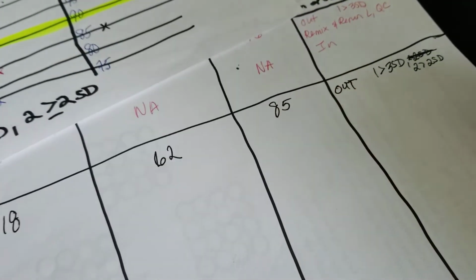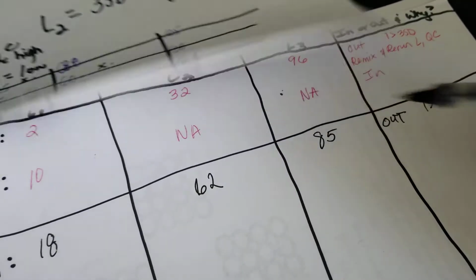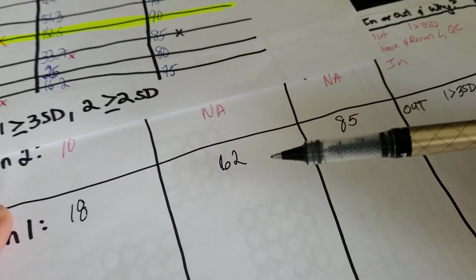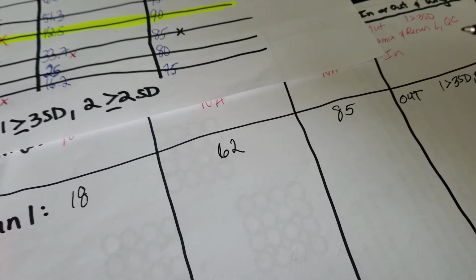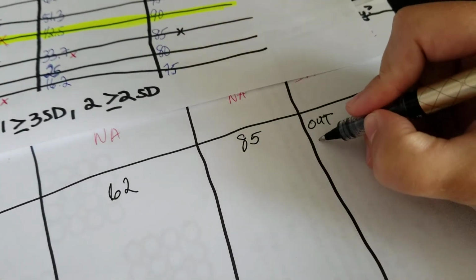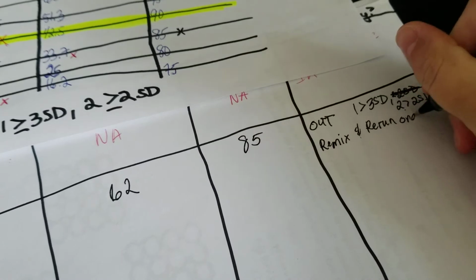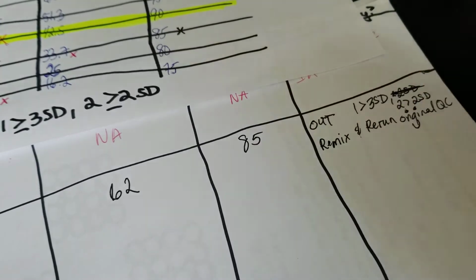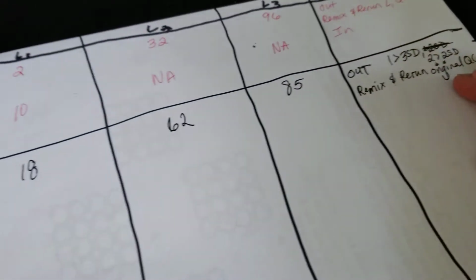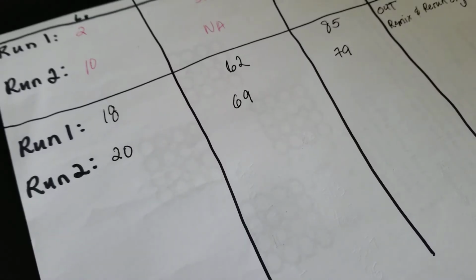So if this is the first time, we're going to rerun basically everything because 2 out of the 3 levels were out. So we're just going to run all of them because 2 out of 3 is not really good. All right. So we are going to remix and rerun original QC. So we're going to say that this is a different analyte. Okay. This is just a practice of how to do this again. Okay, so we're going to do run 2. Okay, so here's the rerun of the original QC.